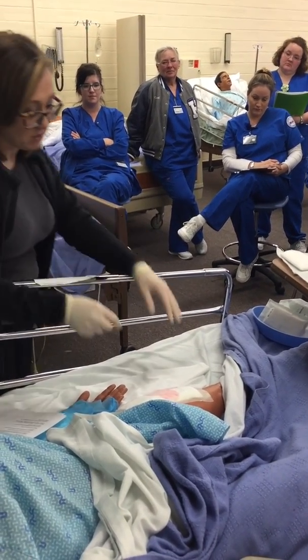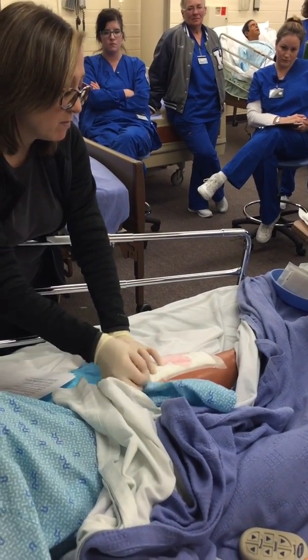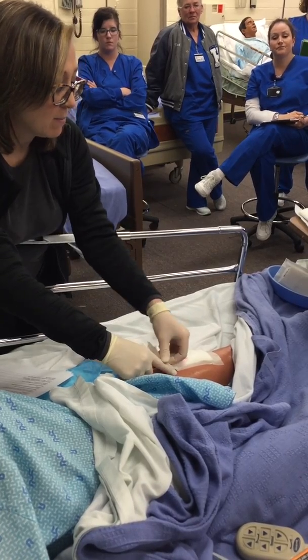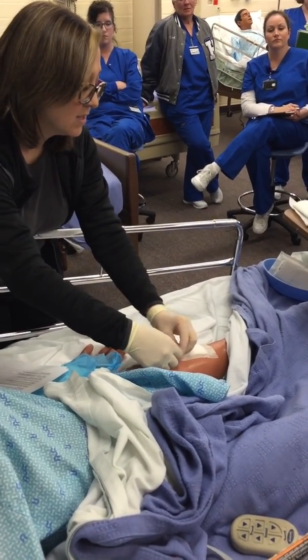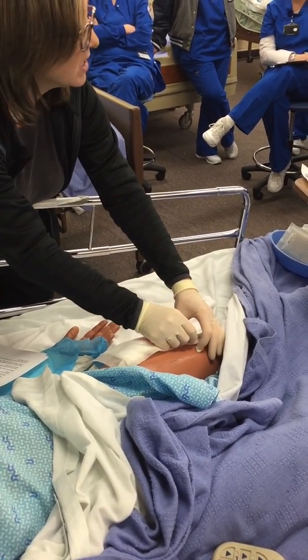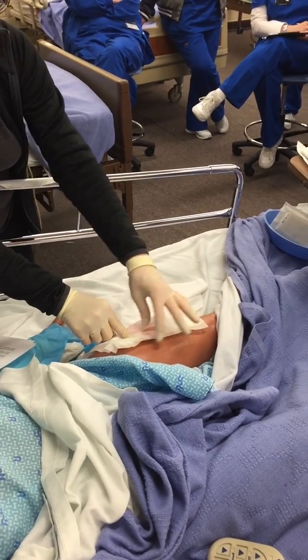What you need to do, when you're actually taking the tape off, is hold the skin down and remove the tape slowly, like so. So you would actually hold the skin and pull the tape. Yes? Because if these people are on steroids, they're going to have paper thin skin, or you're going to end up with a skin tear, and then that's going to be big trouble. So I've got all the tape lifted.